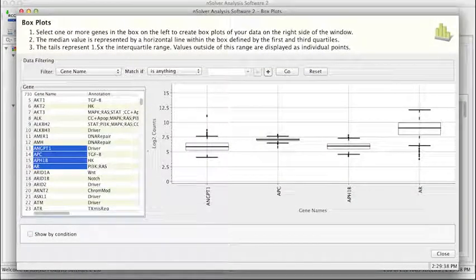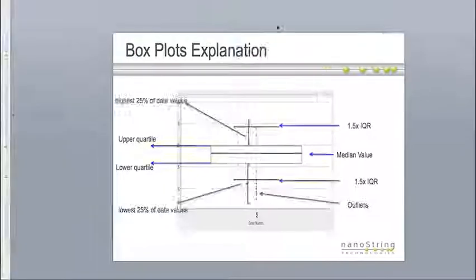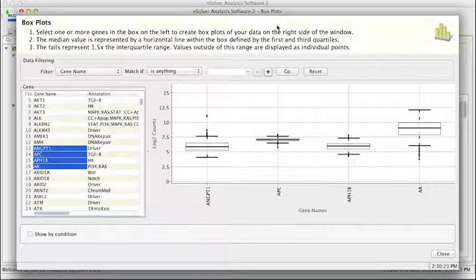Box plots are a convenient way of graphically depicting subsets of your experiment through their quartiles. Box plots have lines extending vertically from their boxes, the so-called whiskers, indicating variability outside the upper and lower quartiles. Outliers may be plotted as individual points. Box plots display differences between subsets of an experiment without making any assumptions about the underlying statistical distribution. They're non-parametric.